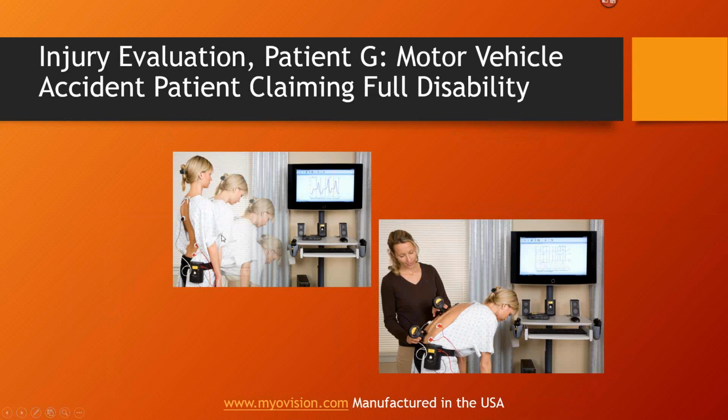This case was an individual, and this is something I've seen more recently too, and this is, again, one of the things that made the DynROM so valuable. This case is an example of somebody who had such a high tolerance for pain that he appeared relatively normal to everybody. The IME, everybody looked at him and was like, what's wrong? This guy seems completely fine. He's not in pain. He had good range of motion.